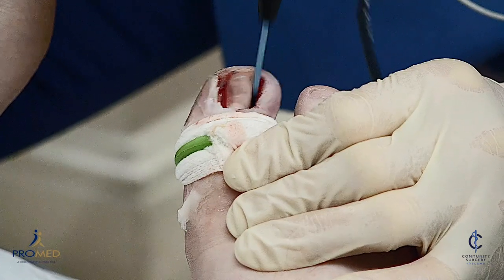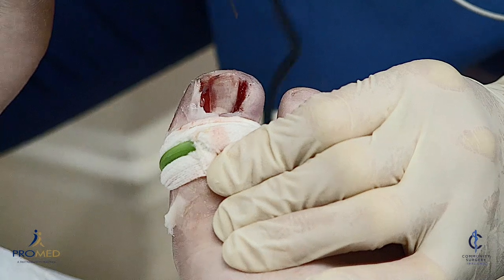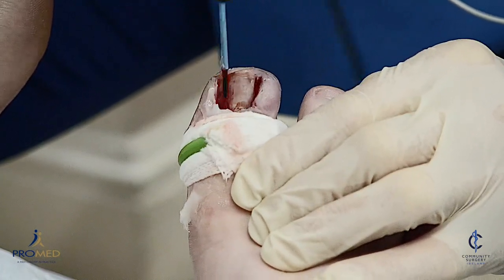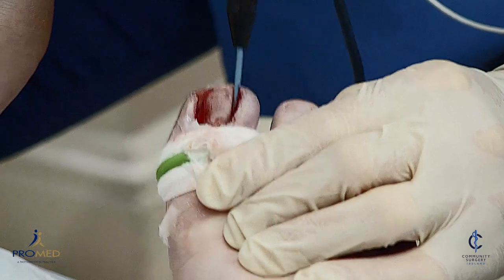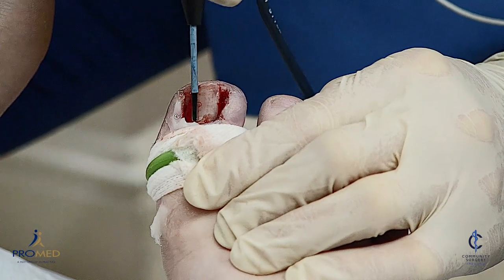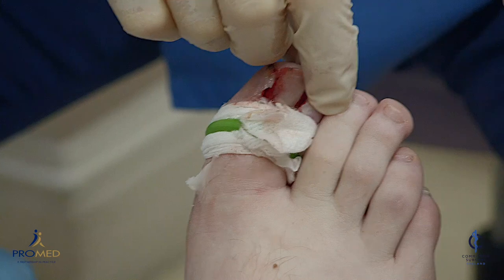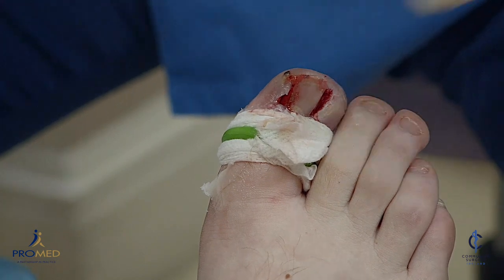Sometimes you hear a bit of crackling and see and smell a bit of smoke. It's about five seconds on each side — you can see a bit of smoke coming through and hear a little crackling. We do five seconds on each corner. With phenol, after one minute each side you'd soak it in methylated spirits to neutralize it — but obviously there's no need to do that with radiosurgery.